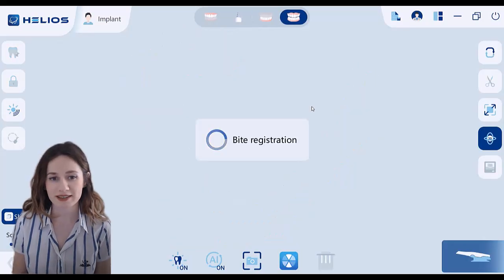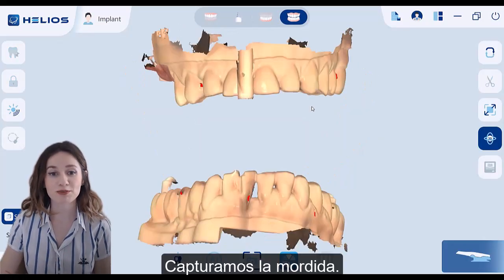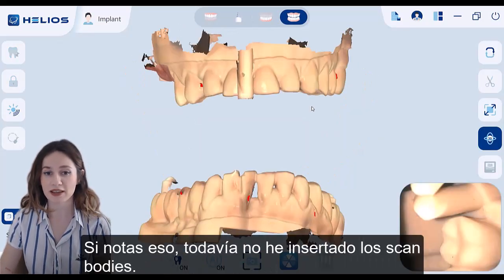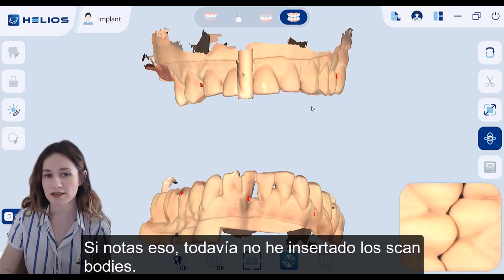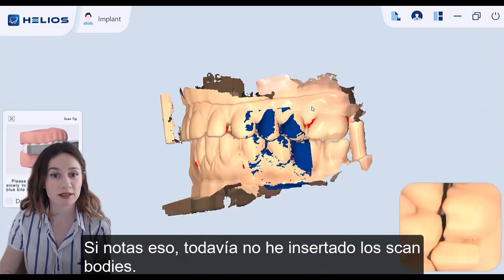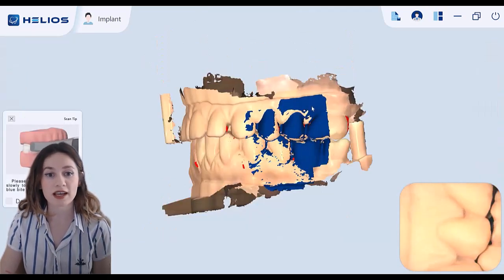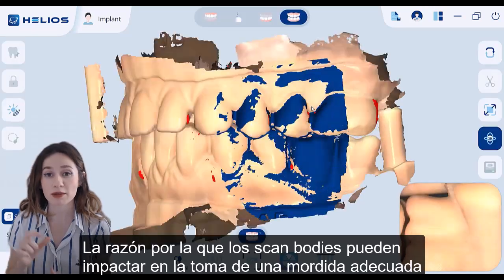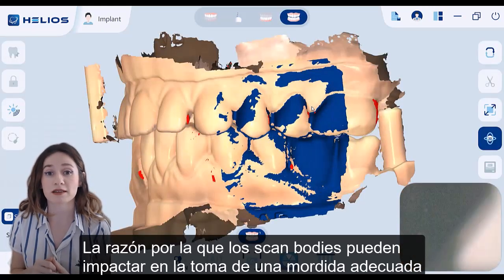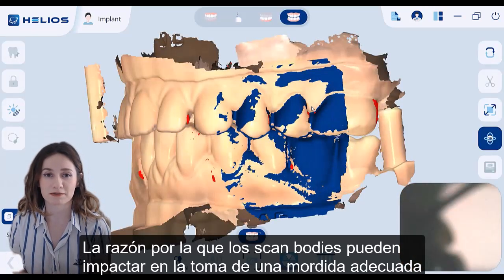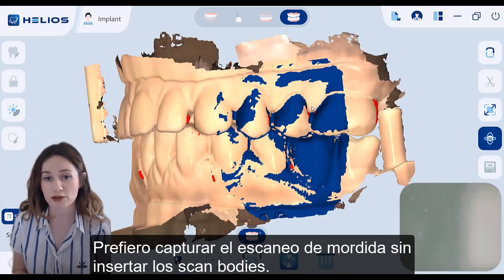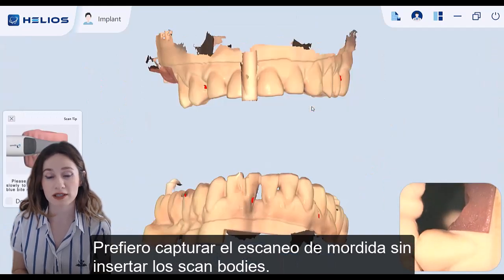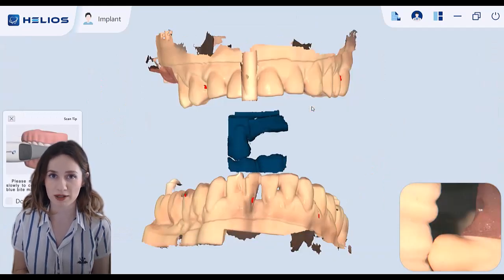Third step is we capture the bite scan. If you notice, I haven't inserted my scan bodies yet. The reason is that scan bodies can be impacted in the bite, so I prefer to capture the bite scan without inserting scan bodies.